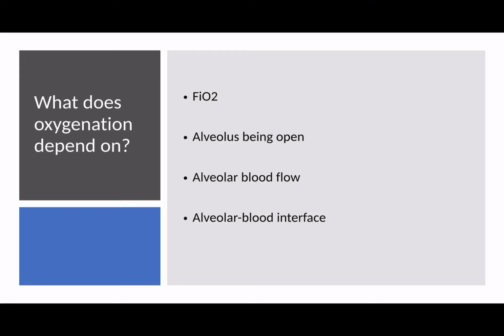The fundamental point of positive pressure ventilation is to try and open up alveoli so that you can improve oxygenation. That is why positive pressure ventilation is the next step up from adding oxygen on using a non-rebreathe bag.